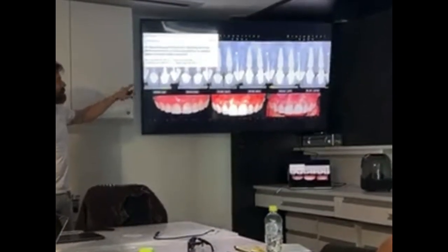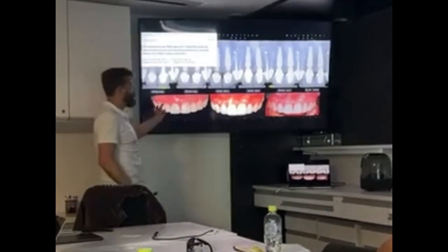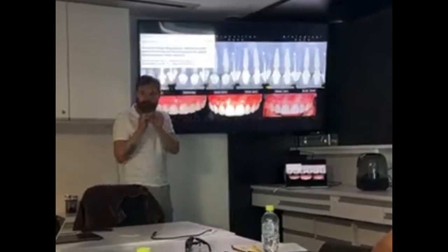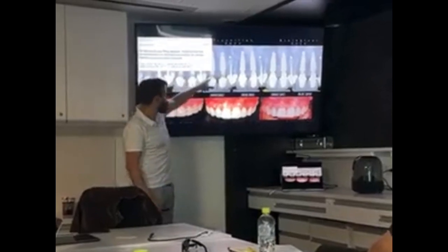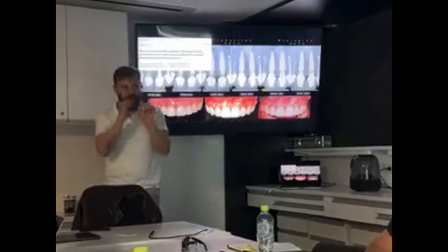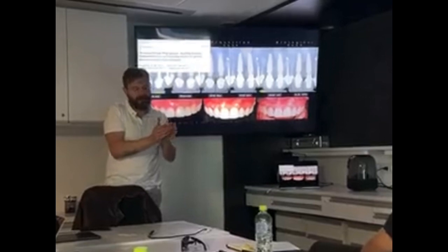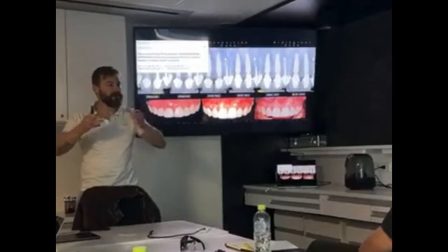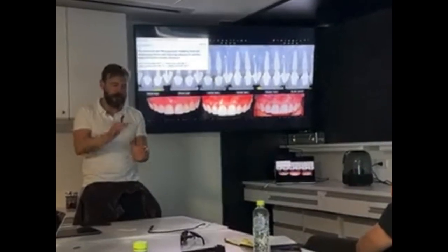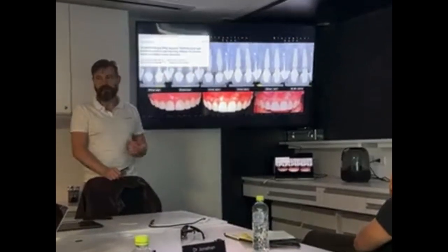We stopped last day in this case, and one very important thing is not just the environment inside the socket. I just commented with you guys, I don't know if I brought exactly the detail, but the biomaterial that you bring inside the socket, you bring a little bit more coronal than the bone crest level. But one important thing is that this biomaterial cannot smash the soft tissue around. You're just going to bring like a cone inside, and what is responsible to maintain that in place and stable is really going to be the provisional.